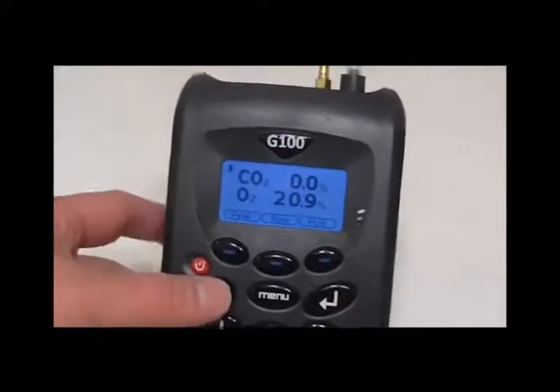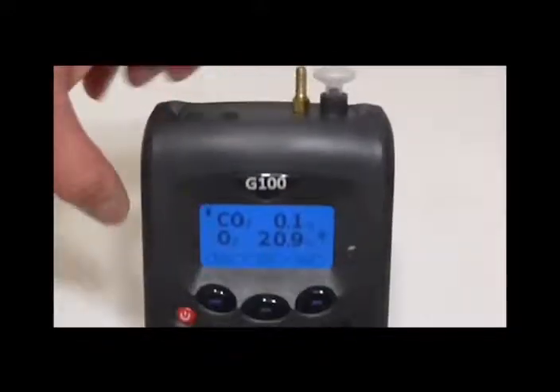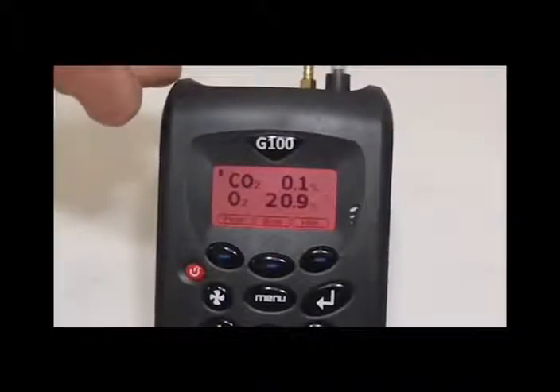Once that is completed, the first step will be to assess the flow fail point. Turn the pump on in the main read screen. If the instrument does not flow fail, the next thing to do will be to ensure the instrument does flow fail correctly — cover the inlet with your finger and the instrument should flow fail within 10 seconds.